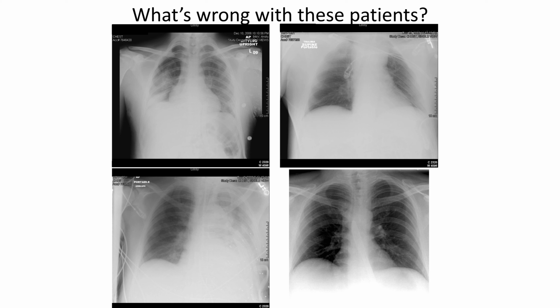Now, the image at the bottom left is also a trauma situation. There's some clues here of what happened. You can see some dark, round, small beads. Those are actually shotgun pellets. This man was shot in the chest by his wife around Christmas time, and this guy came in, and his wife actually came in the ER as well because she was concerned about him apparently. But you can see here that there's some drains and chest tubes and central line put in.